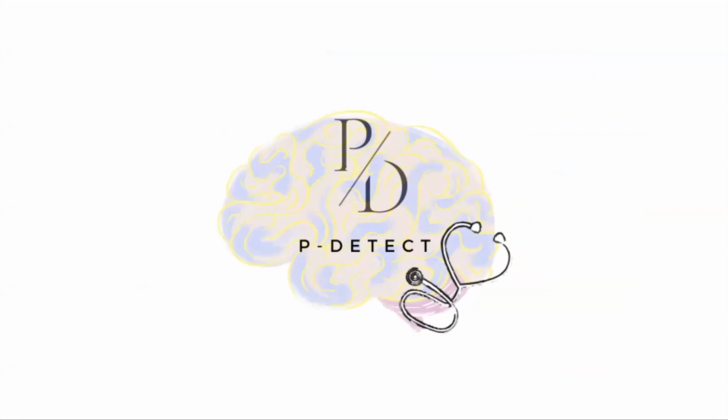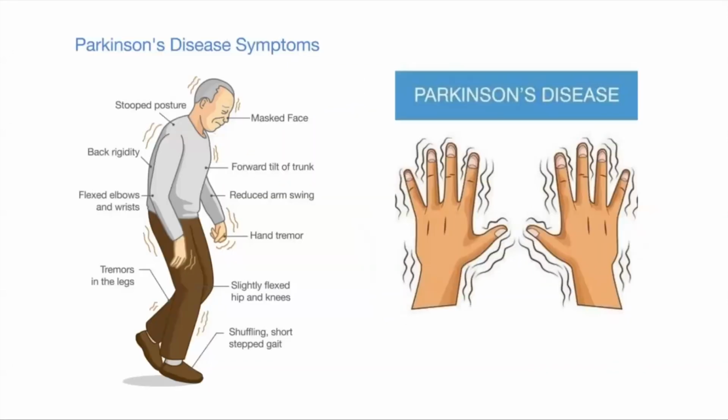PDetect is an AI tool-based web app that can detect if one is suffering from Parkinson's disease using hand-drawn spiral images. Here are some of the many symptoms of Parkinson's disease, and in my app, I choose to diagnose hand tremors. Hand tremors are one of the most characteristic and recognizable motor symptoms of Parkinson's disease. They usually manifest as rhythmic, involuntary shaking or trembling of the hands.